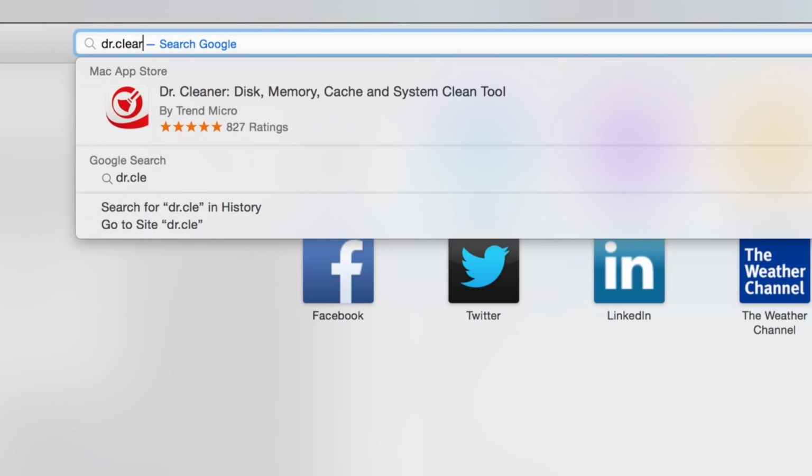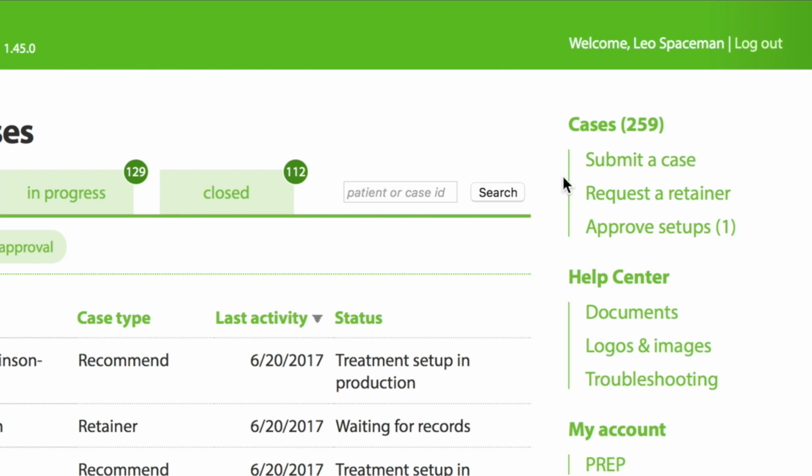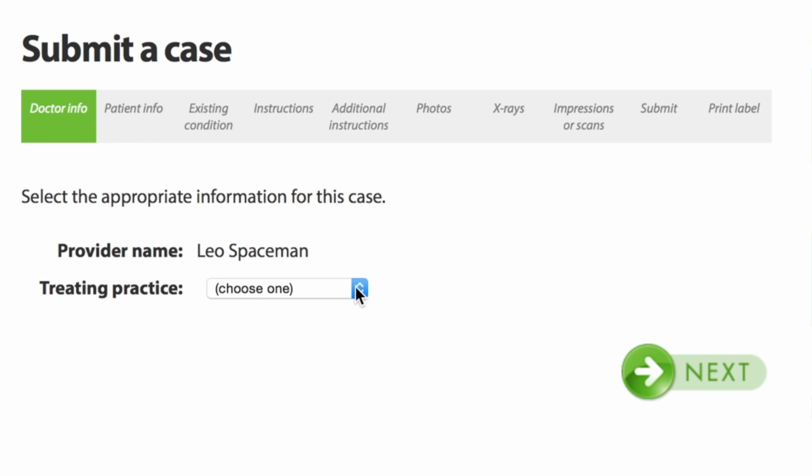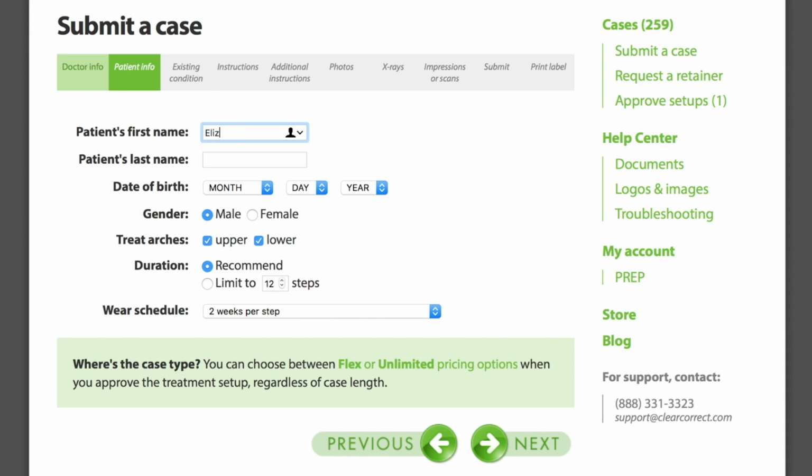When you're ready, log in to doctor.clearcorrect.com. Click Submit a Case in the upper right corner. Choose your practice and click Next. In the next section, enter your patient's name, date of birth, and gender, and let us know whether you're treating one or both arches. By default, we'll plan treatment with the minimum number of steps recommended to try to achieve your prescribed goals. If you choose to limit the duration of treatment, we'll honor that restriction, even if it means stopping short of your other goals.